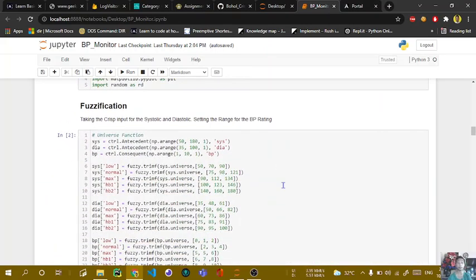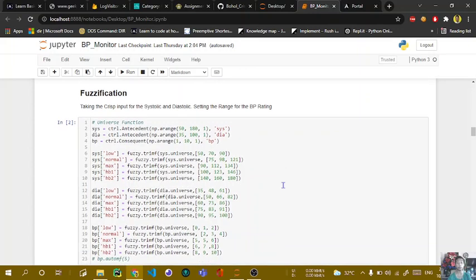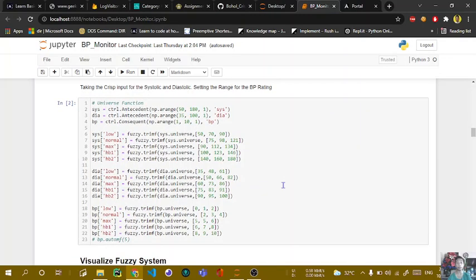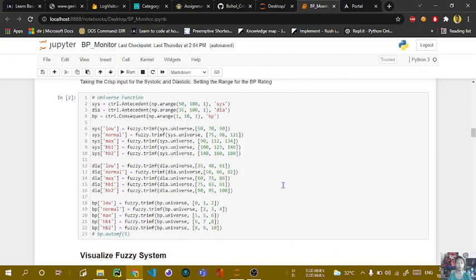So in fuzzification, I set up the systolic range to 50 to 180. Diastolic is 35 to 100, and the consequent, or the result of it, is the BP rating, which is 1 to 10. I categorize it with 5 categories: low, normal, max, high blood 1, and high blood 2.